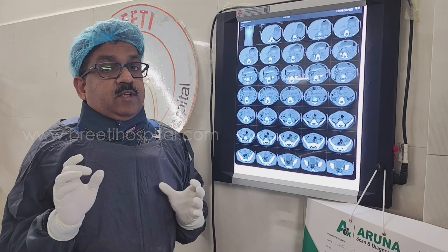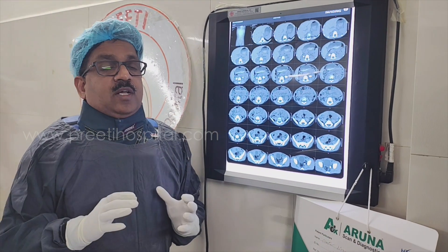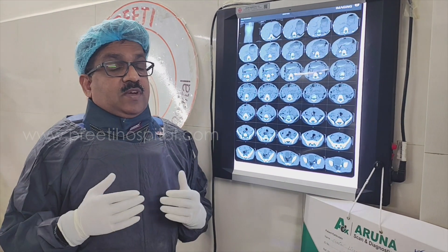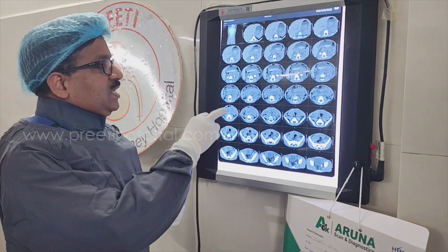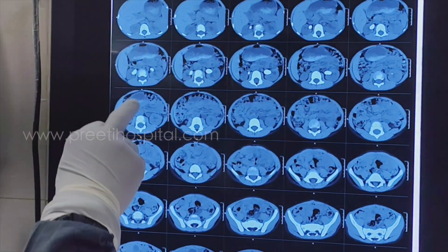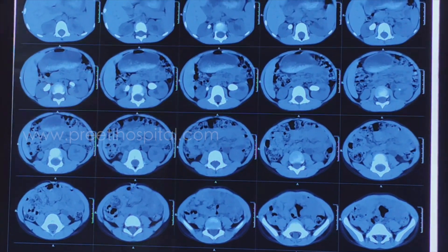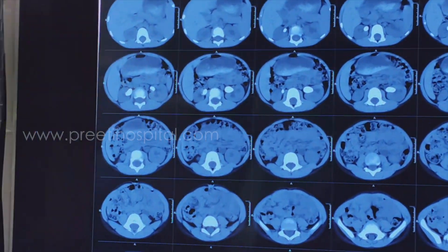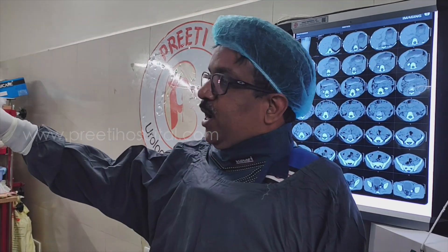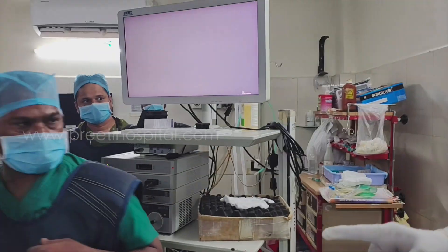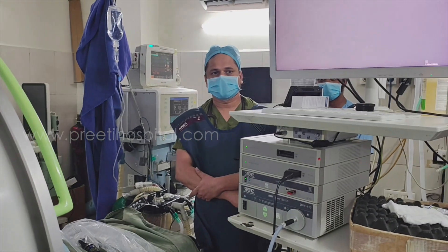X-ray KUB, even though it involves radiation, gives better aid to the surgeon. Many people ask whether to do supine PCNL or prone PCNL. For a case like this, where the stone is occupying the entire pelvis, it does not make much difference — supine or prone. It is your comfort. We will ask the anesthetist: how comfortable are you placing this patient in supine position?